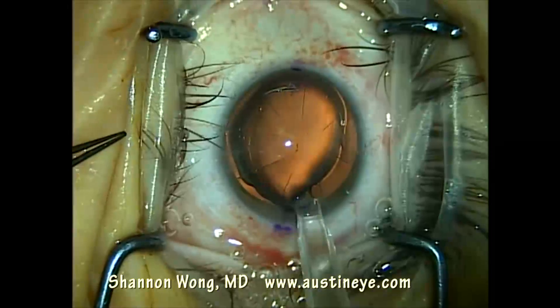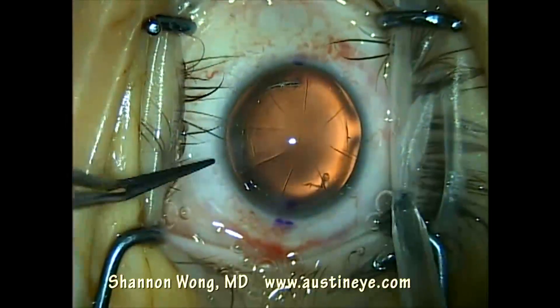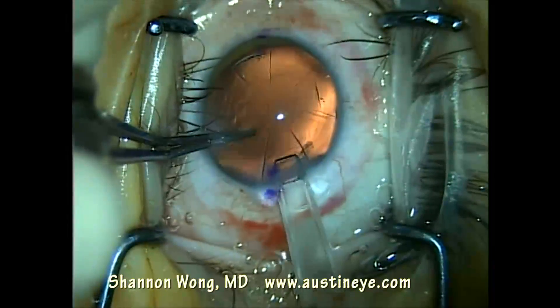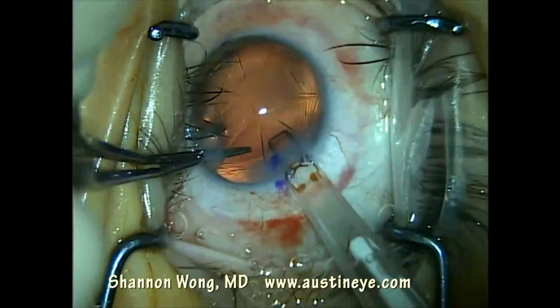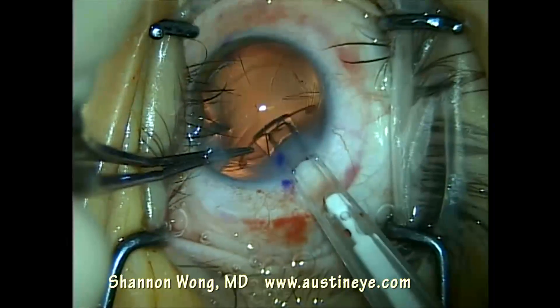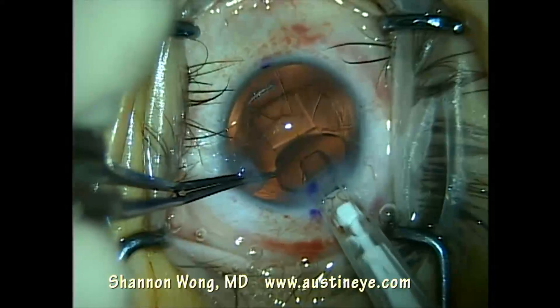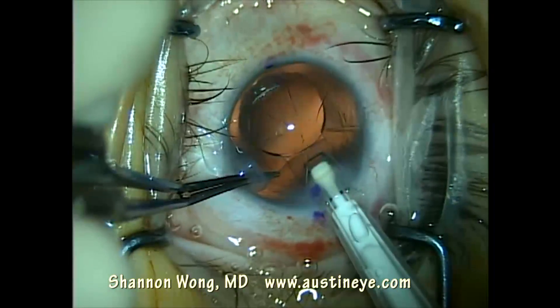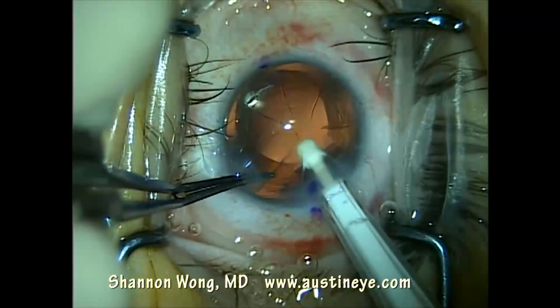We've filled the eye with viscoelastic and now we're going to insert the CrystalLens. I use a CrystalCert. I insert my smooth tying forceps through the secondary incision to stabilize it. I'm careful not to over-stretch this wound — I don't want the arcuate incisions to open up. The CrystalLens AO inserts easily with the CrystalCert.